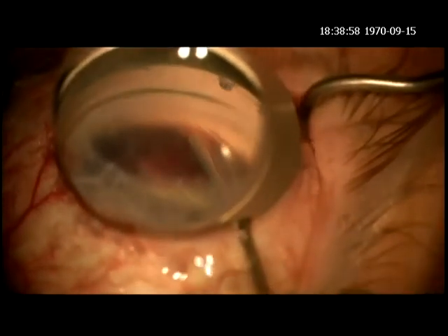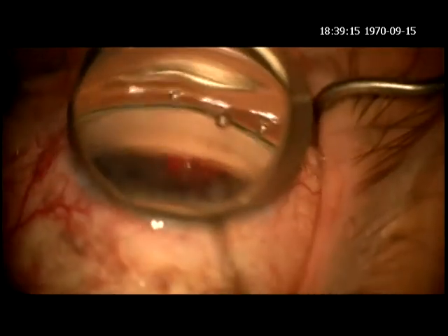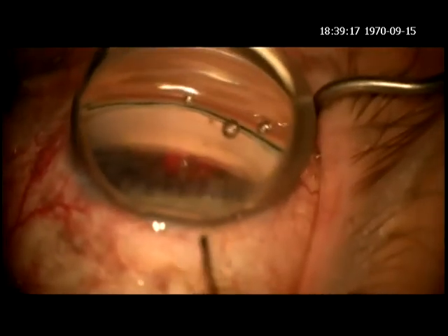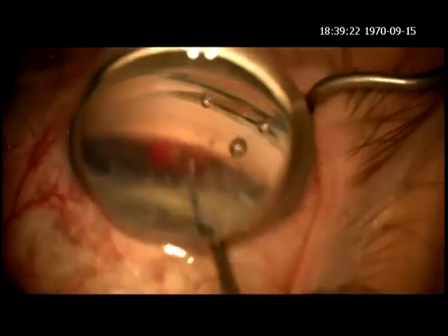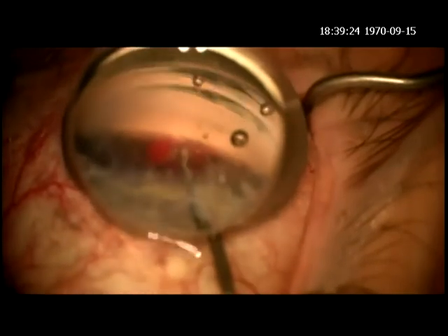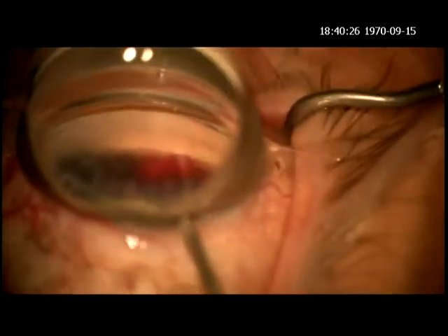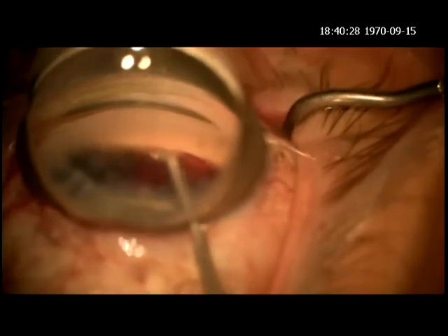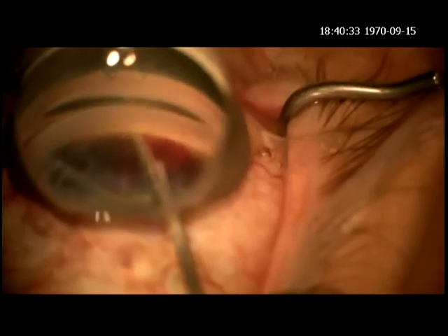The device is placed initially at exactly the place where you'd like it to end up in a patient with an iris. Since the patient's aniridic, I can move it a little more posteriorly to give me a little greater access for the next part of the procedure, which is the Cahook dual blade goniotomy, in an attempt to improve the anterior drainage as well.